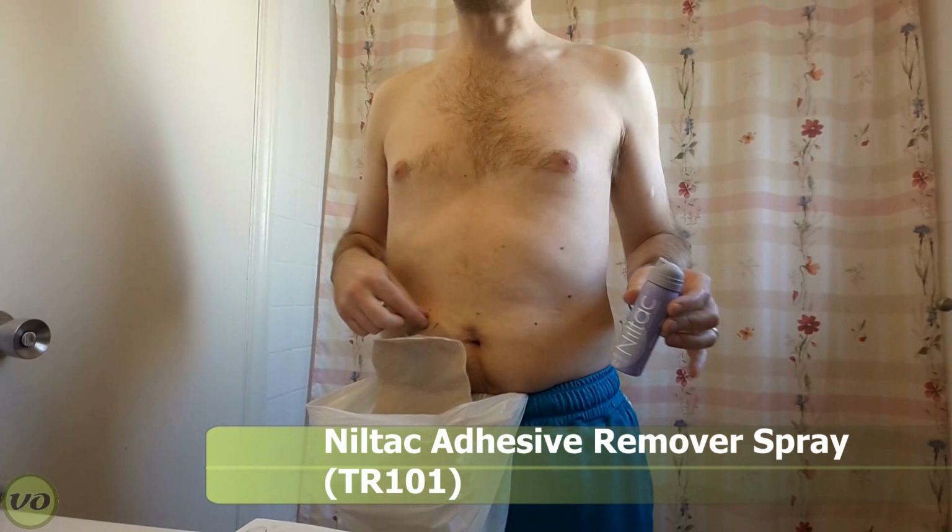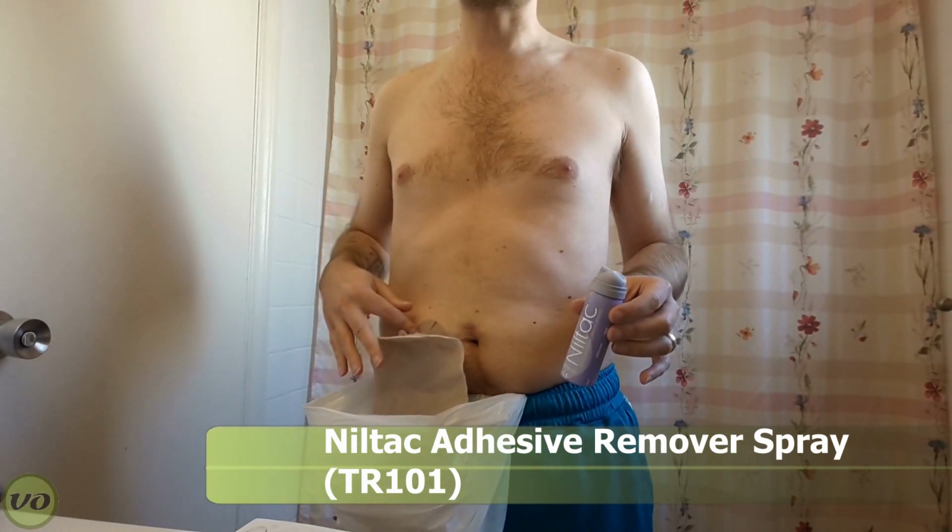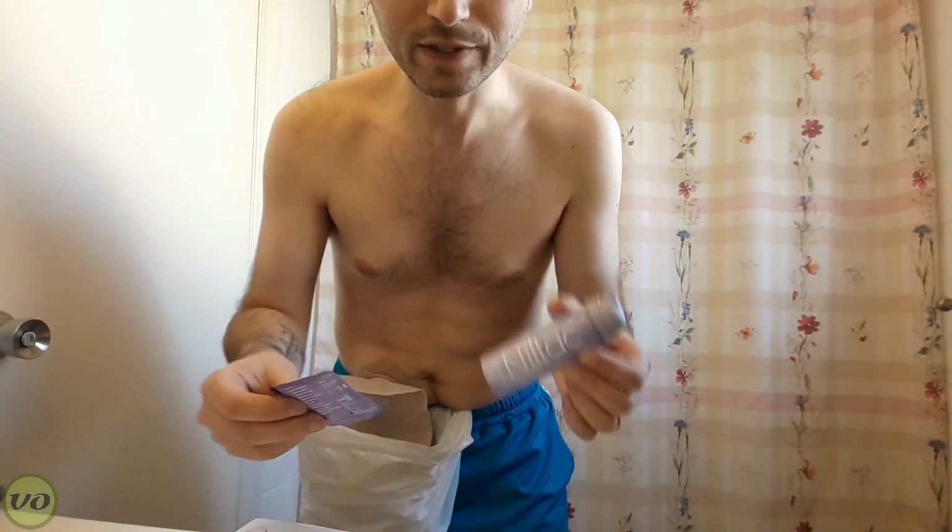Now, adhesive remover sprays are amazing. What they'll do is they'll soften up any of the adhesive that's on your wafer before you actually take the appliance off. Now, I find a big difference between using wipes and a spray, because wipes don't really get underneath your appliance. You still have to peel away, whereas the spray will start to dissolve that adhesive right away. Now, where I do use the wipes is mainly just to clean up any adhesive that might still be left over. And I find with the Hollister tape border flanges, they always have residue. Coloplast, not so much. Convatec a little bit, and some other brands, it's kind of hit and miss.